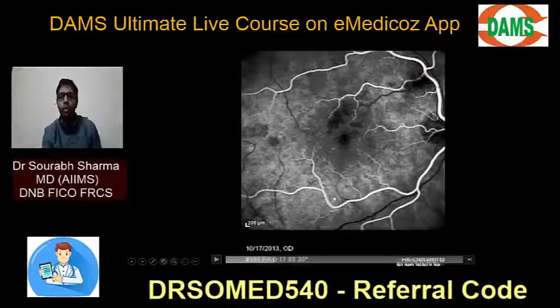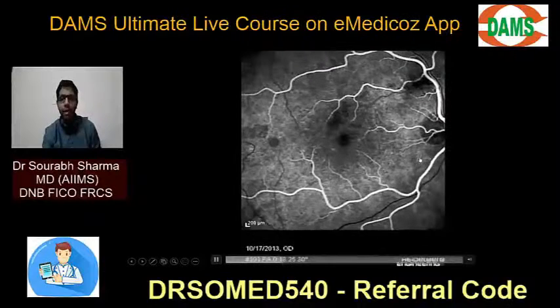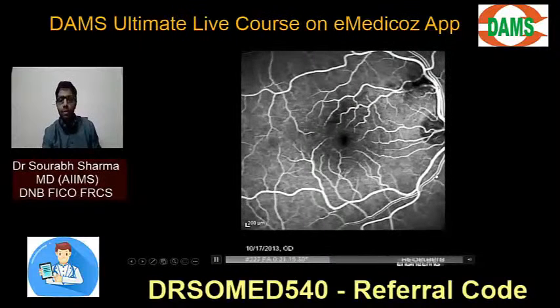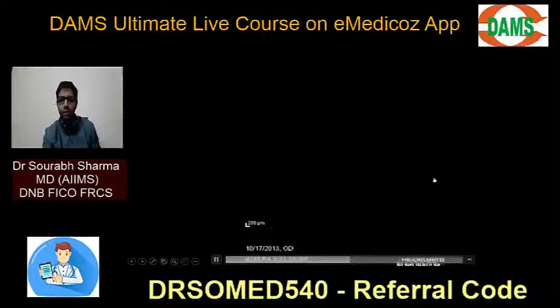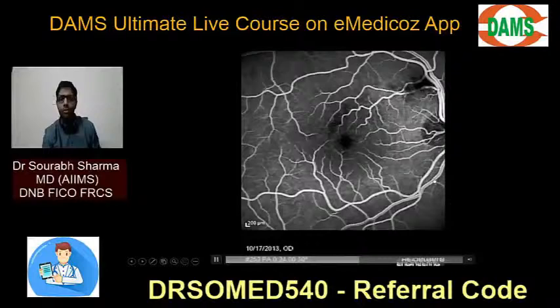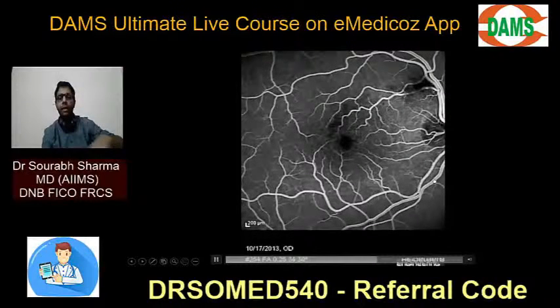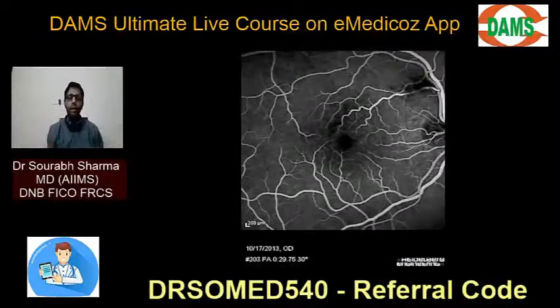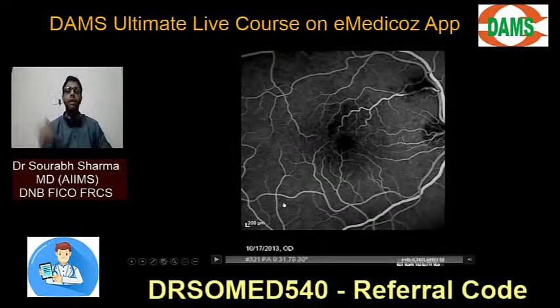What will fill first, artery or vein? What is this, artery or vein? Of course the artery will fill first, and slowly it will go into the vein. Slowly, see, now the vein is filling. See, the vein caliber is more, 2:3, the vein is filling, and it will go out of the retina. It will recirculate many times, then it will go out of the retina in 10 minutes time. In 10 minutes, everywhere, the dye will go out of the retina. So we take multiple photographs at various levels.